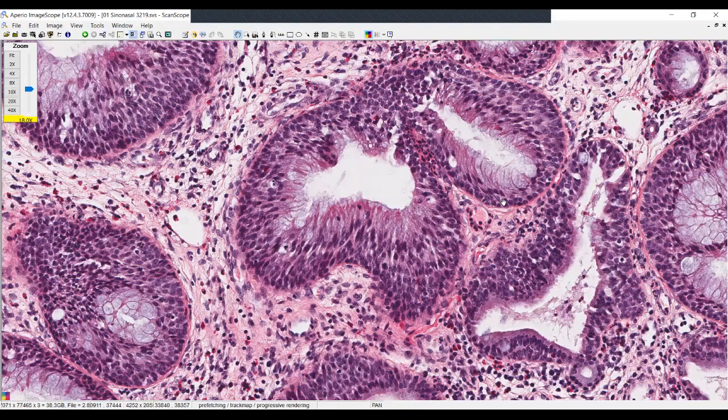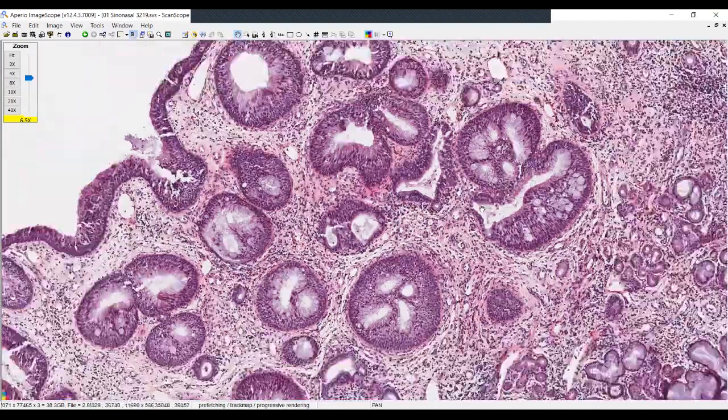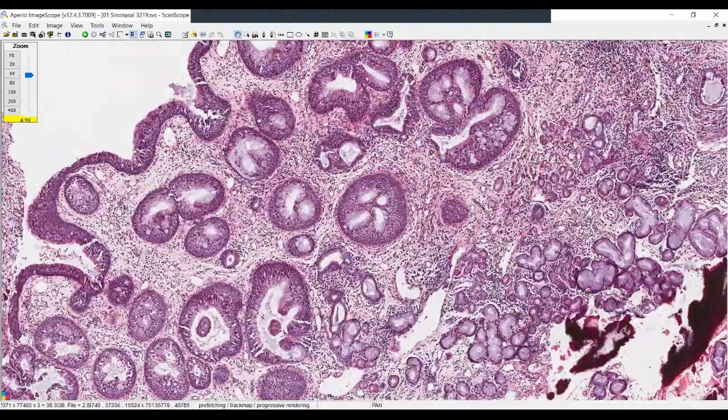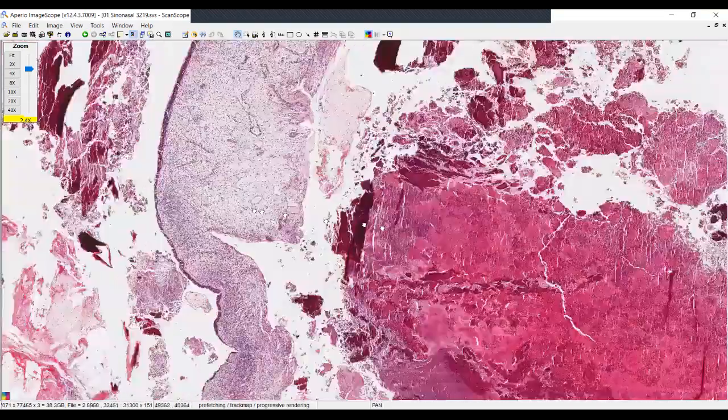And while there are very rare variants of ciliated carcinoma, for the most part when I see cilia, I can be assured that I'm dealing with a more or less benign lesion. So as I look at that, I can tell that this probably for me is a good example of a respiratory epithelial adenomatoid hamartoma. I don't think that this represents an area of adenocarcinoma. There is no back-to-back gland formation. There's no destructive growth that would be present in that particular space.